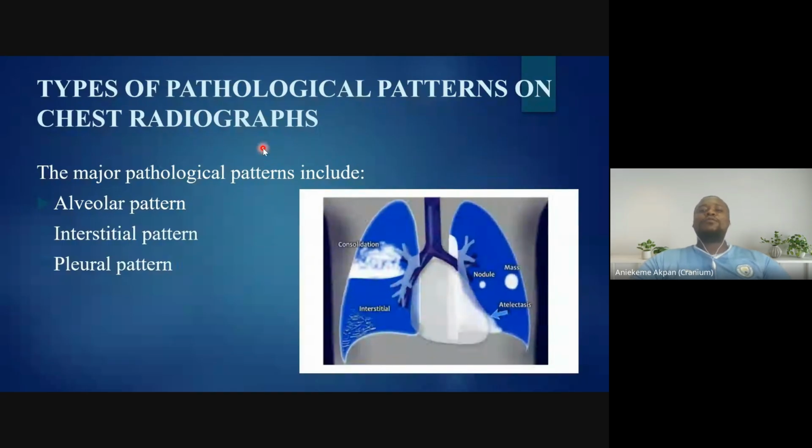So that means you will have to go back. That will delay clinical decision. If it's a case of emergency, they might not know what to do. They have to wait for you to go back and look at the radiogram. That's why the systematic approach is very important, so that the part that they have queried and the part that they have not queried, you are going to assess them.